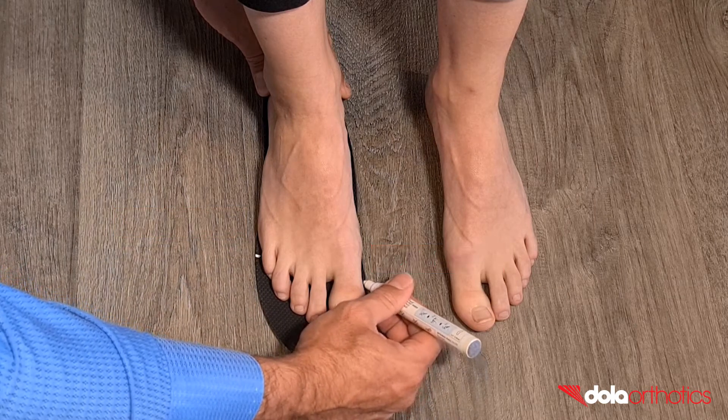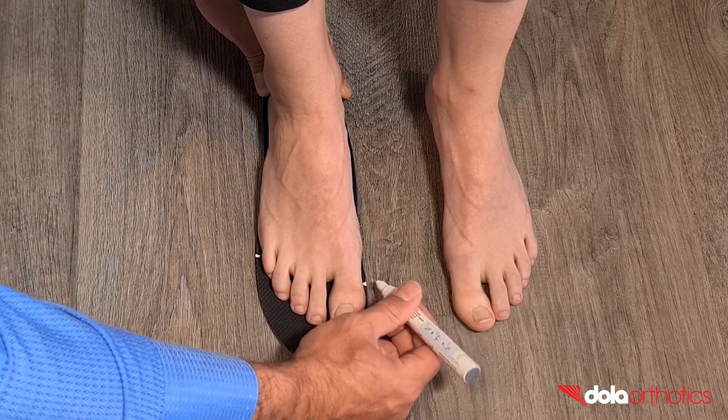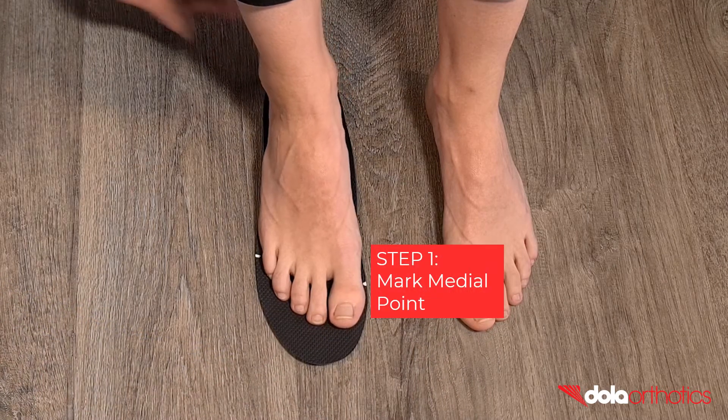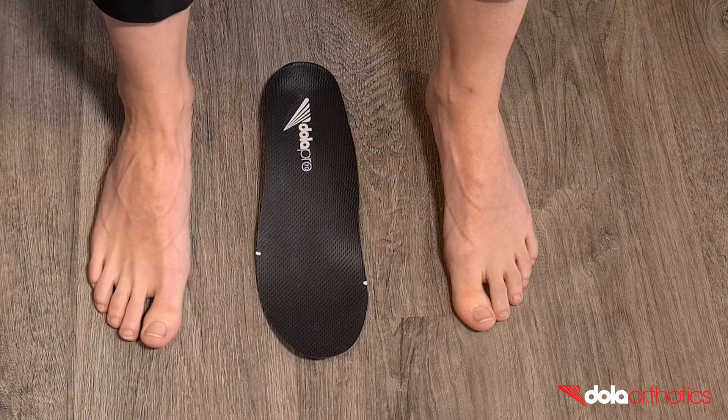Have the patient stand on the orthotic and mark the landmarks in their weight bearing position. Step 1: Mark the medial side of the extension. This will commonly be the sulcus of the hallux.